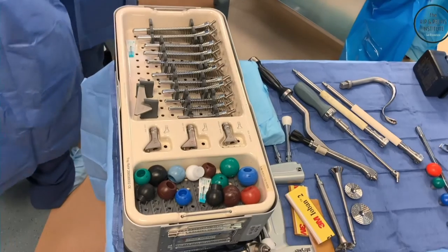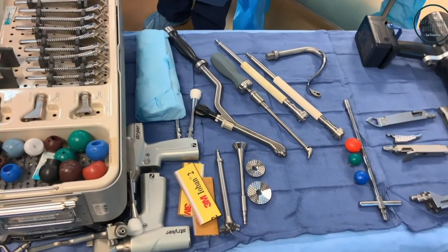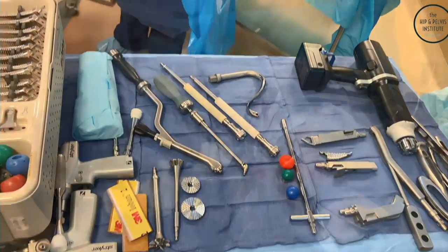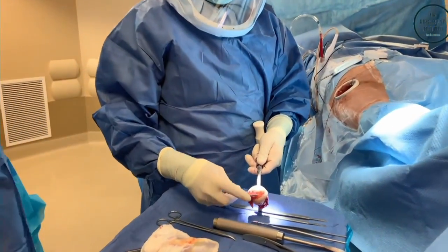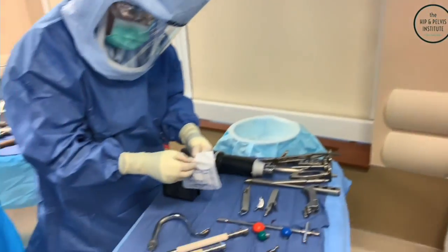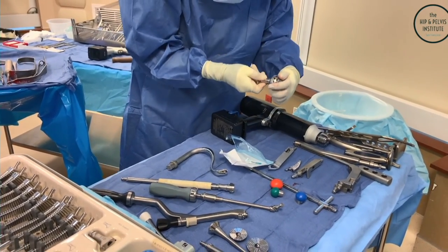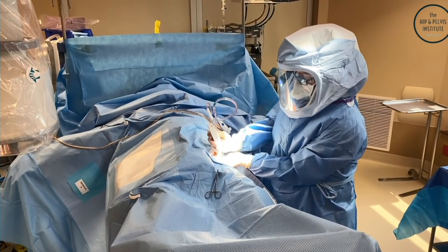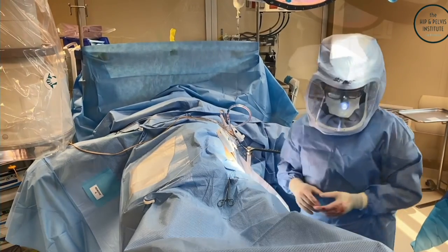The setup's minimalist, so this is our back table. During course of the procedure, we're selecting a reamer. We don't have a reamer pan. We size it and open up our peel-packed reamers for what we need. Typically just one reamer. We've got improved ergonomics related to the fact that, you know, you don't have somebody in there reaching, having to work around a C-arm.